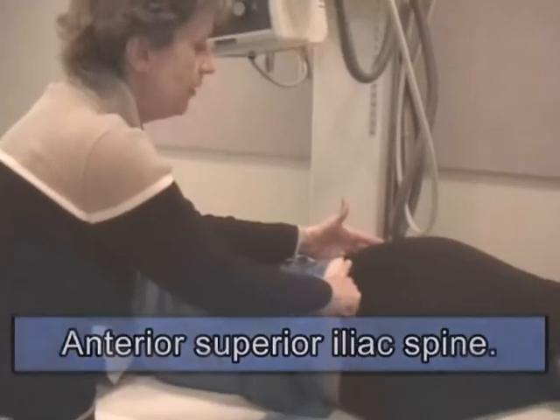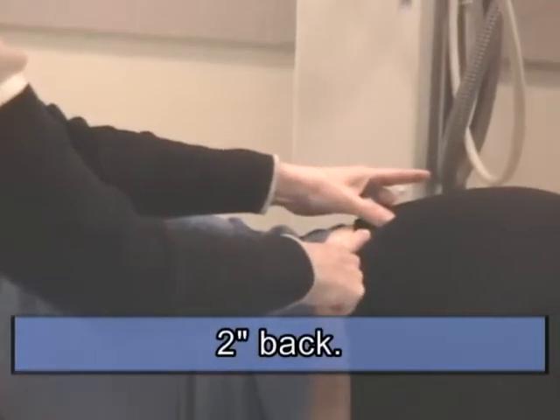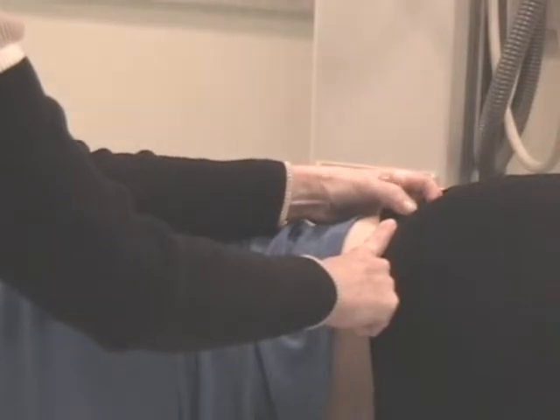And then I feel for the anterior superior iliac spine, and I'm 2 inches back from that. A lot of times with patients, my 2 fingers will line up. They just match. They meet in the center, and that's where I'd put the central ray. In Drea's case, here's the crest, 2 inches down. There's the ASIS, and 2 inches back. I'm going to kind of compromise between those 2 points, and that's where I'm going to put the central ray. Again, 2 inches inferior to the iliac crest, 2 inches posterior to the ASIS, and then I compromise between those 2 marks on this particular patient.